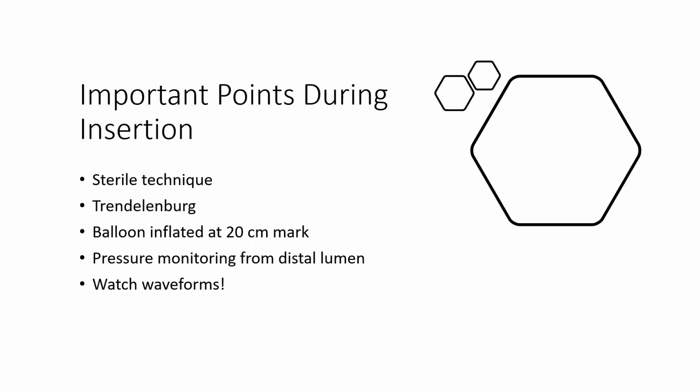Now, whenever we are assisting in this procedure, even if you are not a cardiac cath nurse or an OR nurse, you are expected to know what your functions are during the insertion. You're going to have to watch the monitor for changes in the waveforms, as well as arrhythmias that might be present.